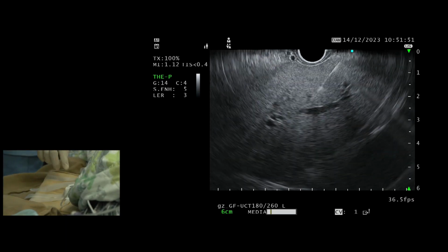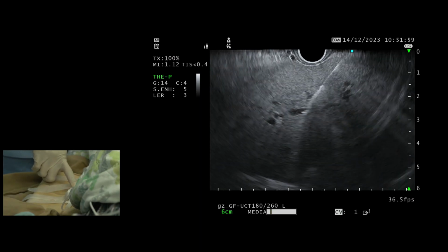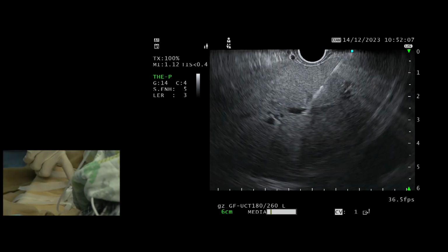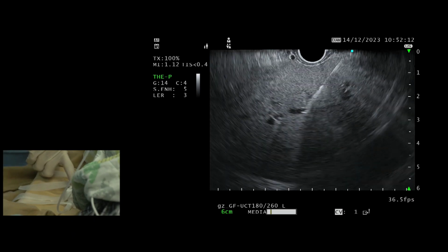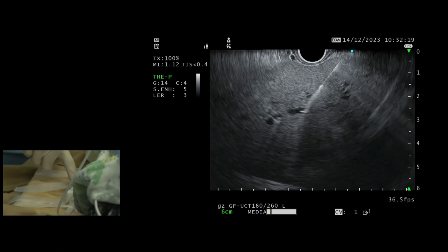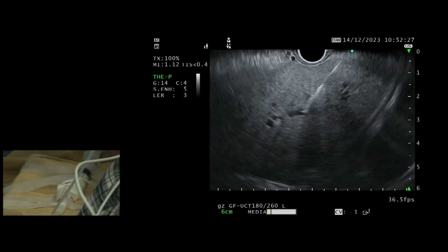Okay, good. Do you do several measurements and then take the average? Yeah, so what we do is we want to get 3 consecutive measurements that we feel are reliable. So if we get quite a bit of variability, we'll continue until we get 3 consecutive that are close together. So what are the common reasons that the values vary? Yeah, for example, a bubble in the needle can do that. So now we're getting 15. All right, let's flush again. Okay. Okay, that's good.